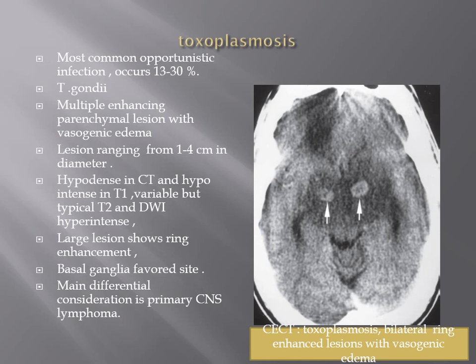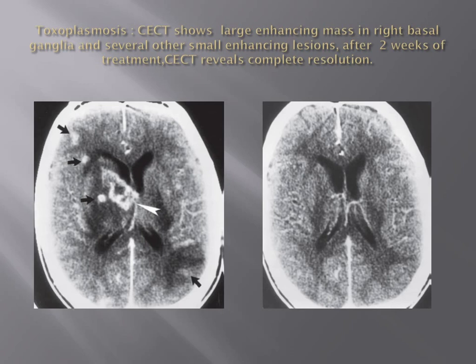Toxoplasmosis. After treatment, complete resolution.